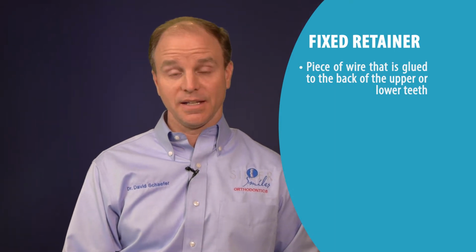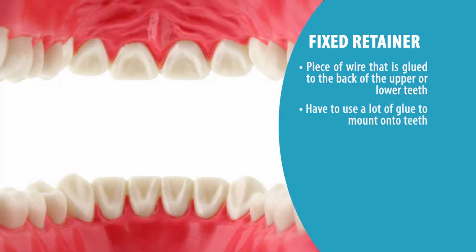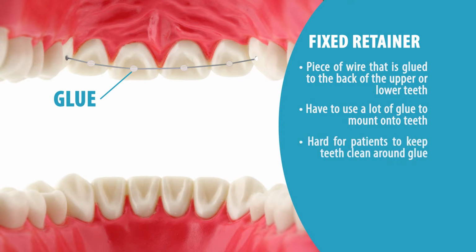But one thing I see with a lot of our adults coming in today that's very important to talk about with these fixed retainers: I tell patients, in order for a fixed retainer to be effective, we have to use a lot of glue and glue it on the back of each tooth that the retainer attaches to. So what happens when we do that is it's very hard for patients to properly clean, and eventually over time, plaque will start building up.